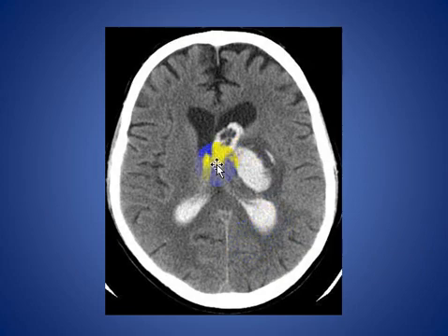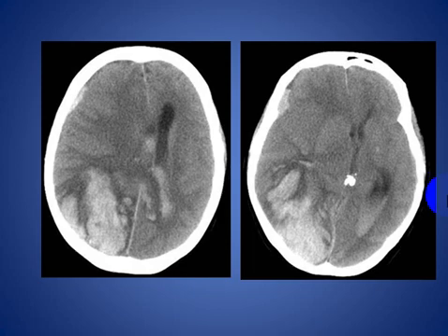Here, another patient with acute intraparenchymal bleeding in the left thalamic region extended to the ventricular system. And this patient on warfarin has a large bleeding in the right occipital region and subdural space, extended to the ventricular system with mass effect.